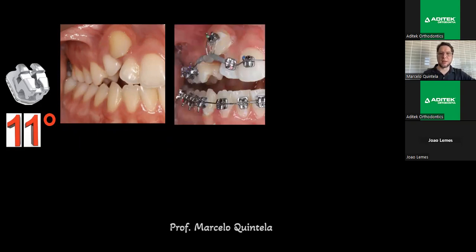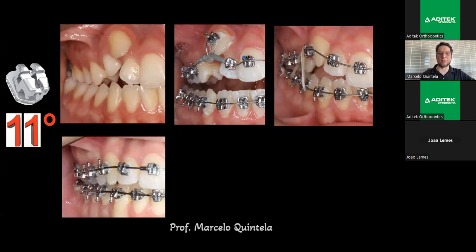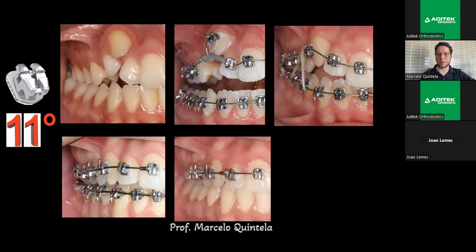Look at this sequence. Work at a distance, to not do notching, binding, nothing. Now you put the archwire into the slots, and we have a binding in a round archwire. Now you are with a 1425 archwire, and look at the root. But this torque in this Plus prescription EasyClip is 11. So the crown will be there, stopped, and the root will have a palatinization.